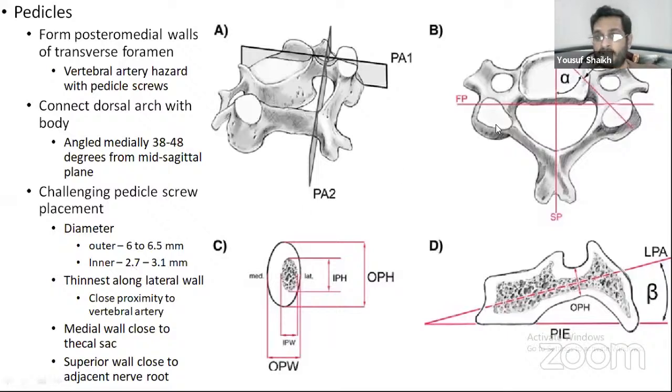The second important element is that, as you can appreciate in this diagram, this is the pedicle. So if you want to put in a pedicle screw, the direction has to be quite neat. Through a posterior approach, especially in fat patients, having such a 45-degree angle is quite difficult, and you need to do a lot of muscle retraction. Other than that, it usually does not make sense to utilize this small portion of the pedicle and probably jeopardize the possibility of injuring the vertebral artery here and the spinal cord over here.